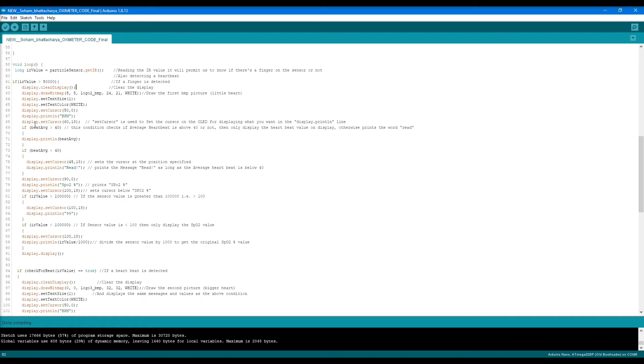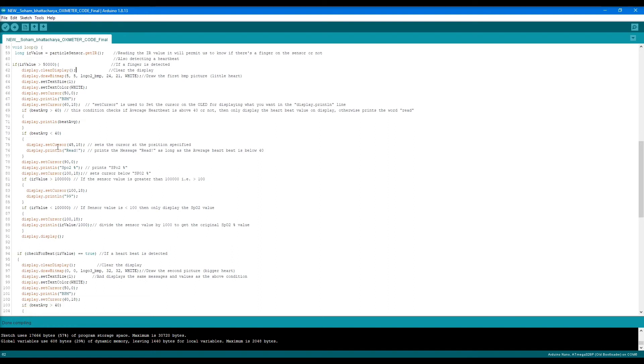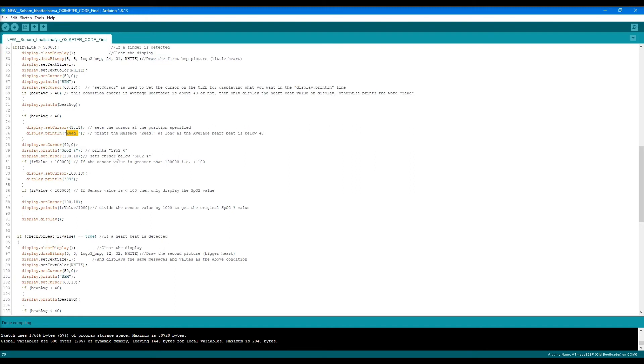We set the cursor again and display the average beats per minute that we're storing from the sensor into the beat average variable. If the beat average value is greater than 40, we display it. This is my custom coding. If it's lower than 40, it shows the message as highlighted in line 76.